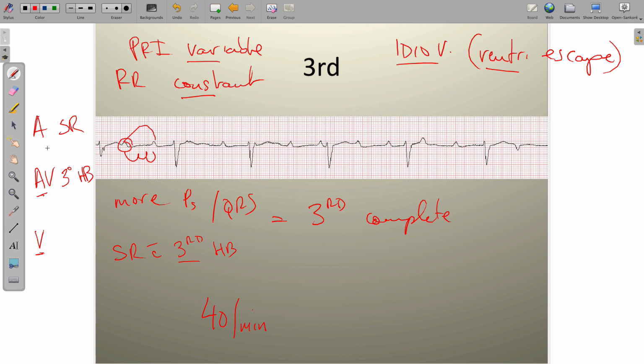So if the sinus node fails, or if the AV node fails to transmit the sinus node's impulses, and if the underlying rate coming from above that is allowed to reach the ventricles falls below the inherent firing rate of the ventricular tissue, then the ventricles assume the primary pacemaking capability, and this is called a ventricular escape rhythm.